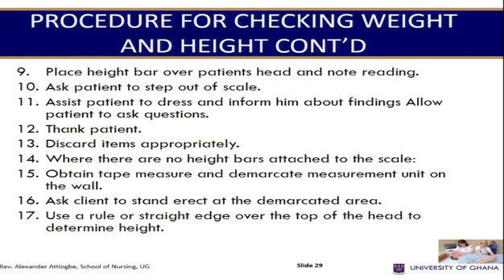Allow patient to ask questions. Thank patient. Discard items appropriately. Where there are no height bars attached to the scale, obtain the tape measure and demarcate measurement unit on the wall. Ask client to stand erect at the demarcated area. Use a rule or a straight edge over the top of the head to determine height.